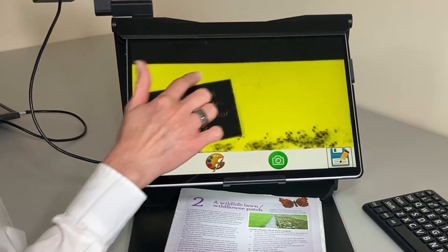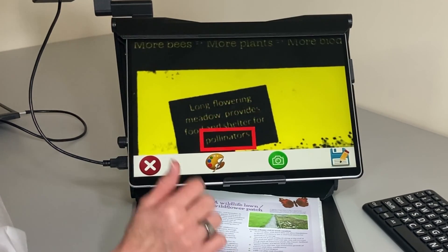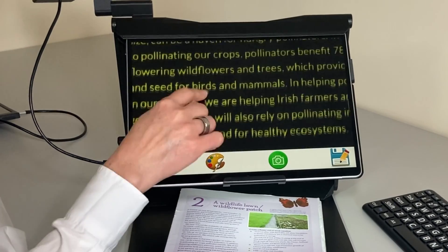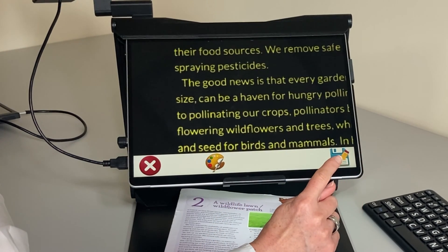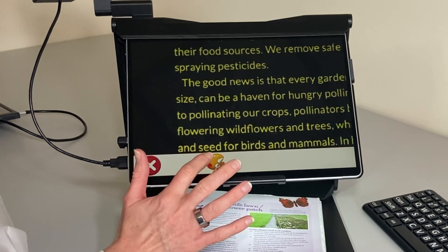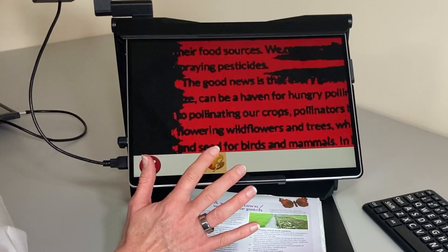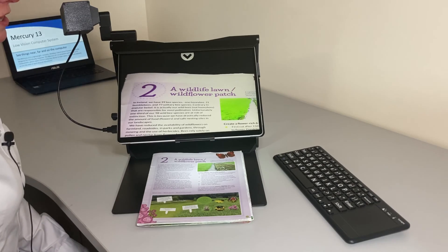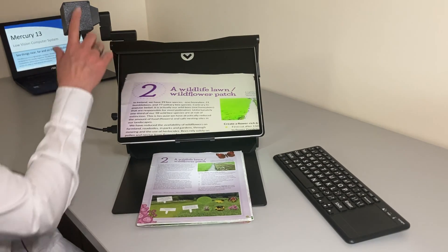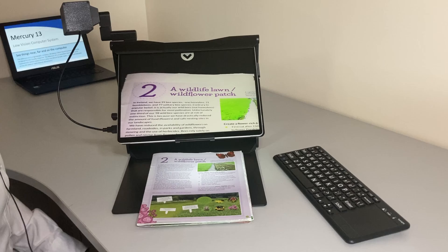I can zoom in and choose to read from a different part of the page — for example: 'Long flowering meadow provides shelter for pollinators.' We can make sure we save that picture, and there is also another floppy disk icon to save the text from the page. We can adjust our colors as well. Now we're going to look at the distance magnification, which uses the distance camera plugged into the Surface through a USB port.